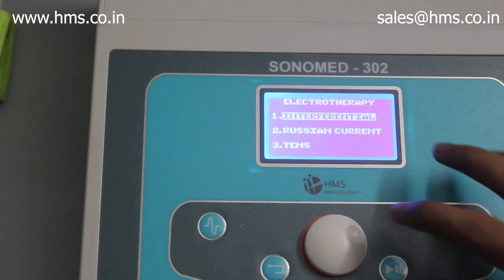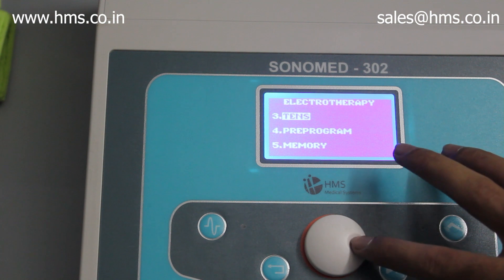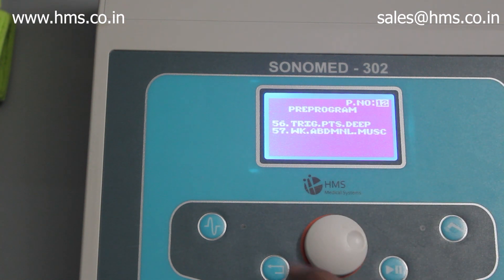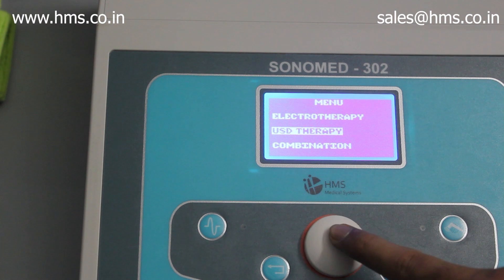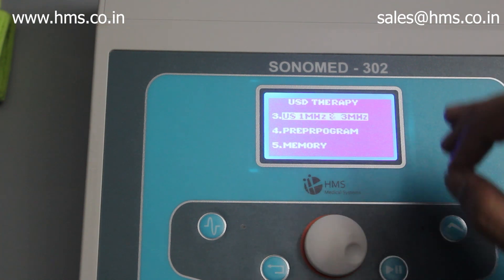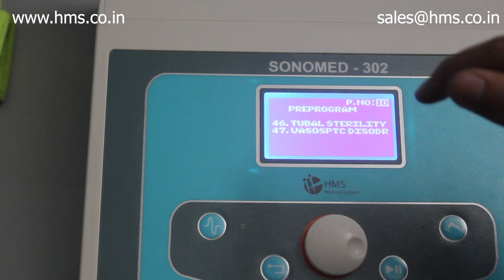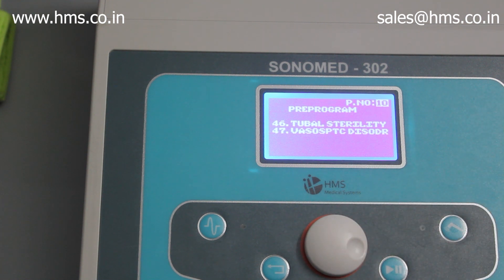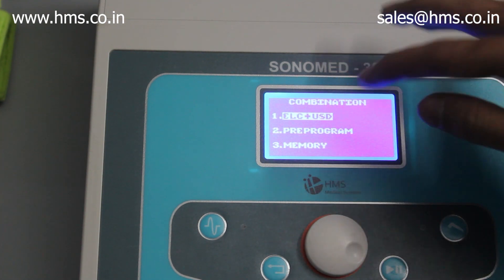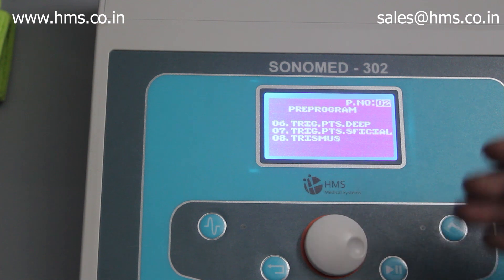In electrotherapy, the three modalities available are IFT, Russian current, and TENS, along with 57 pre-programs. For ultrasound therapy, you have support for both 1 MHz and 3 MHz, as well as a combination of both frequencies, and 47 pre-programs. You can also give combinational therapy — both electrotherapy and ultrasound at the same time — and there are 8 pre-programs available for combinational therapy.